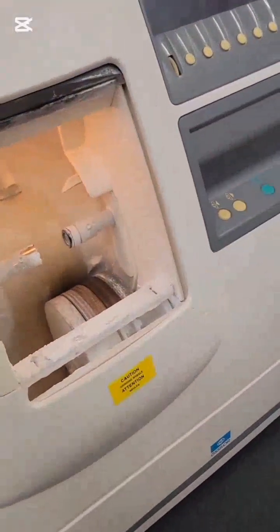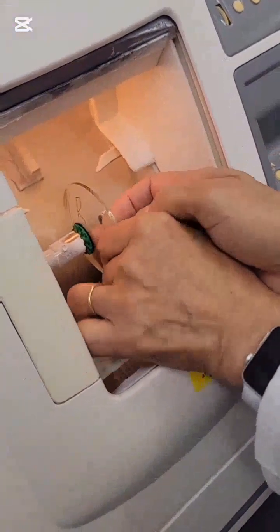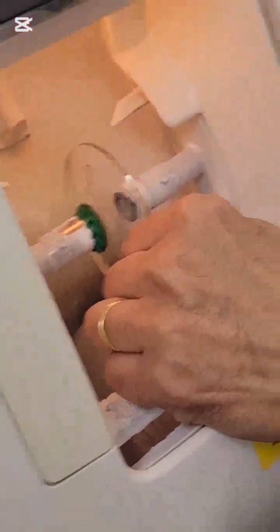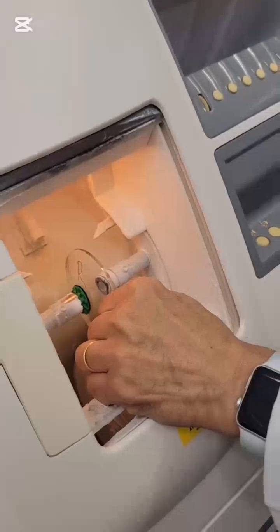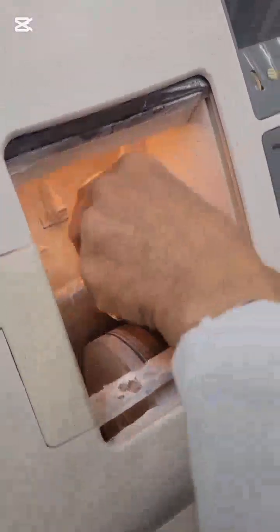On the backside of blocker, there is pin which is supposed to fit properly with the chuck. There are pins on the chuck which holds the lens. Before closing the chuck, make sure that blocker and chuck are aligned properly in the pins, otherwise the lens will be loose and may get damaged while edging. It's best practice to hold lens firmly with either right or left hand when closing the chuck.